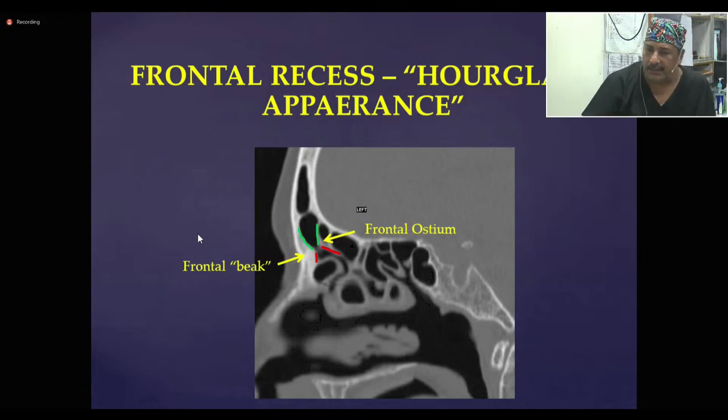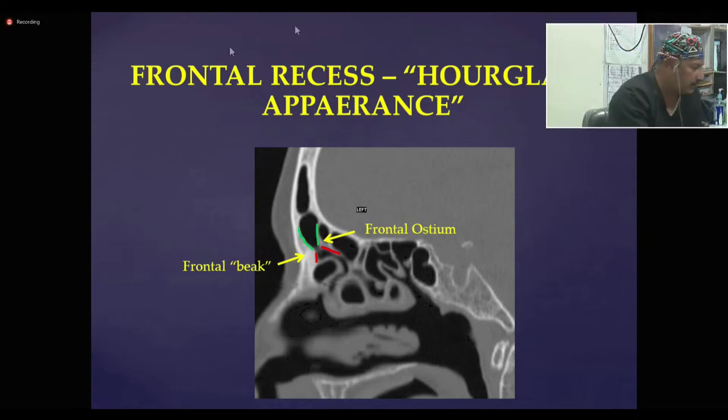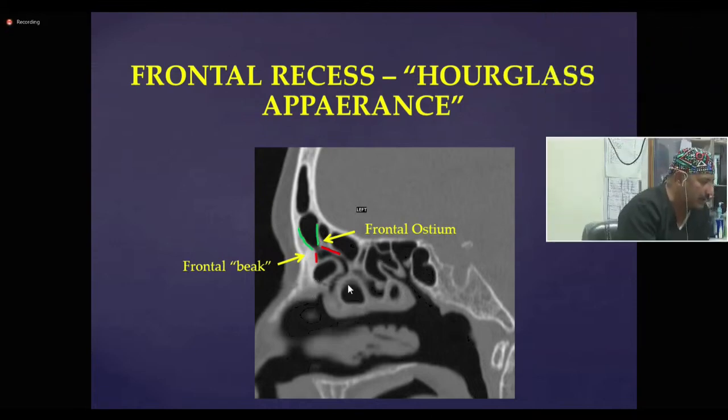The most important thing in the radiology, when it comes to radiology regarding the frontal sinus, the most important reconstruction is the sagittal section reconstruction. Right? Sagittal sections are most important in knowing the anterior-posterior anatomy and the relationship with the skull base and the beak. This is one of the most important sections by means of which you get pinpoint details of the frontal sinus.